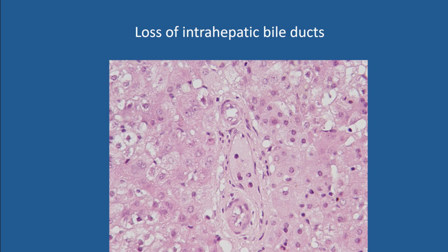So here, for example, is a portal tract, and we have two profiles of the arterioles, and there is the portal vein. Now, these two profiles, as I just told you, could be normal because dyads are normal, and there may not be a bile duct in the portal tracts. In about 7% of portal tracts, we do not have bile ducts.